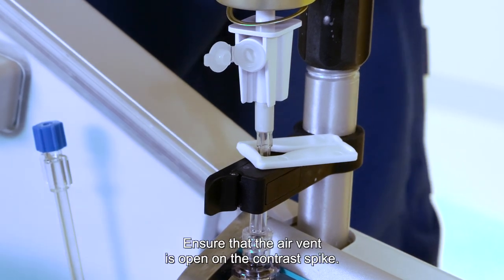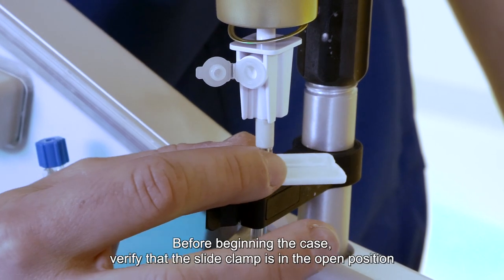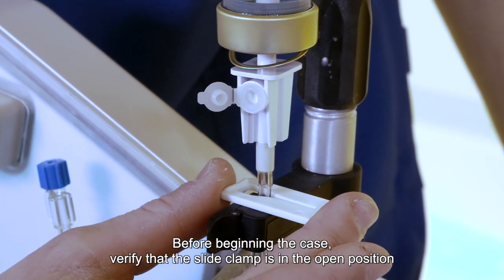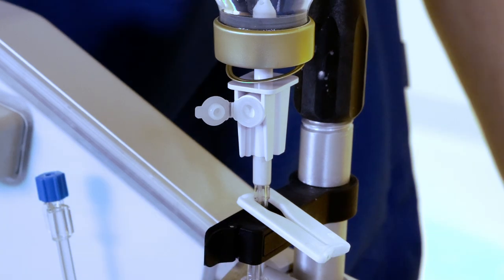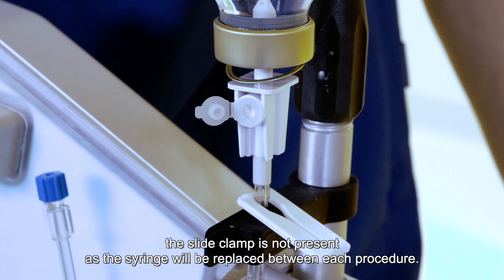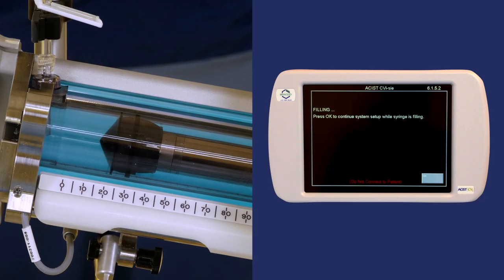Step 6. Ensure that the air vent is open on the contrast spike. Step 7. Before beginning the case, verify that the slide clamp is in the open position and above the contrast sensor. For the single-use syringe A1000/A1000V, the slide clamp is not present as the syringe will be replaced between each procedure. Press Done to fill the syringe.